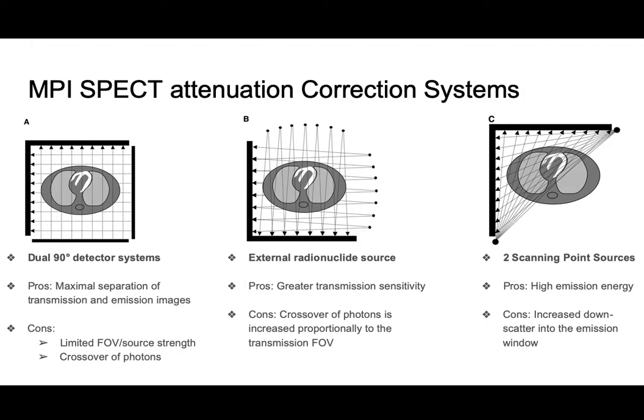So I think those are maybe two separate points, right? One is if you're doing this at the same time, and now you have photons hitting the detectors with different energies, you don't want to lump them together, right? You don't want to lump the radionuclide that you injected with whatever you're emitting for the CT scan. That's kind of a simultaneous temporal problem.